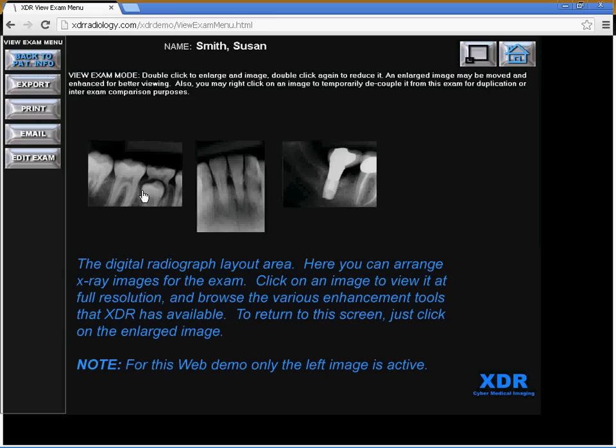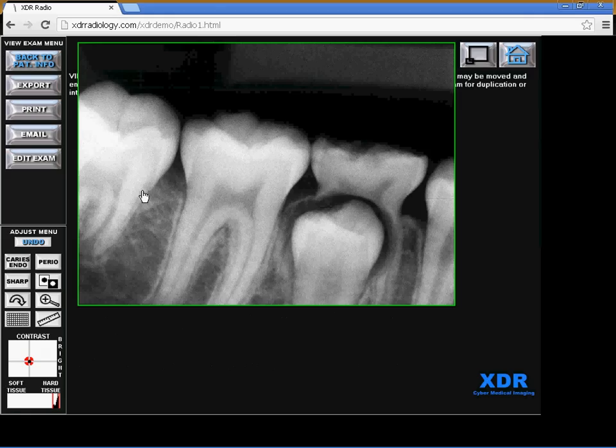If you click on any particular image, you can view it at full resolution and browse the various enhancement tools that XDR makes available. And to return to the screen, just click on the enlarged image. Let's click on this left image and you have access to all of the tools.